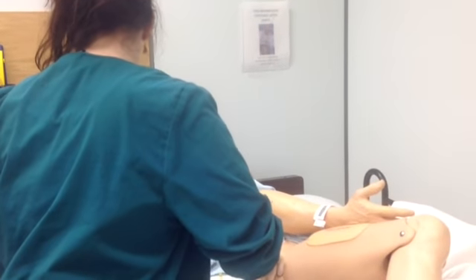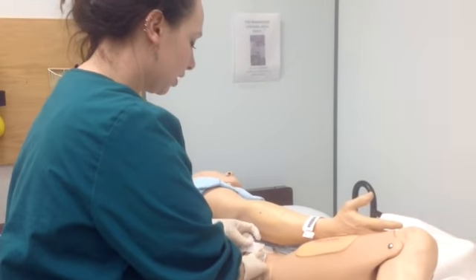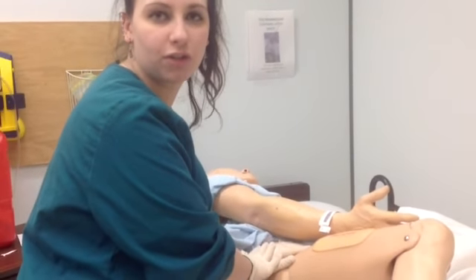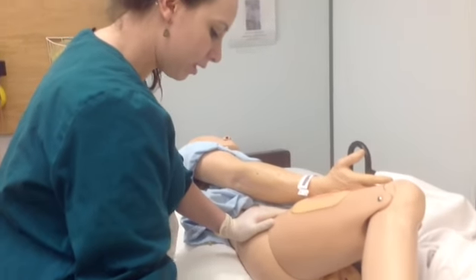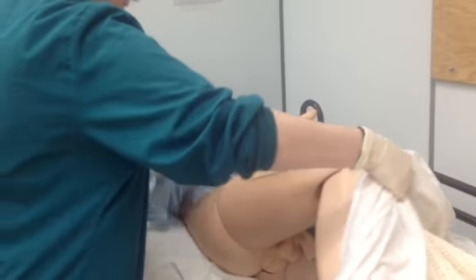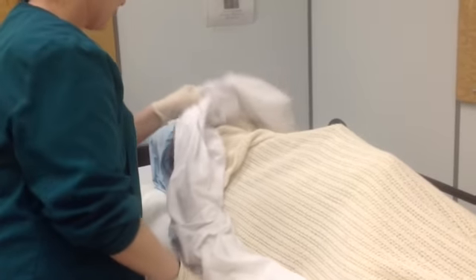And then I'm just going to put a Band-Aid that I makeshift here just for comfort for the patient. I'm going to take the needle. I'm going to throw it away. Okay. Thank you very much. Not so difficult, right? Alright.